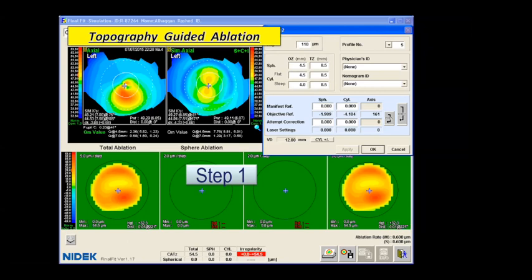We know that the epithelium reduces the error. So suppose you have 100% error, the epithelium will make it only 40. So when you remove the epithelium and you treat only the 40, because this is what you have in your hand, you measured it when the epithelium is on. So you are not removing everything. You know that. Okay, I hope I reached. Maybe. No problem.